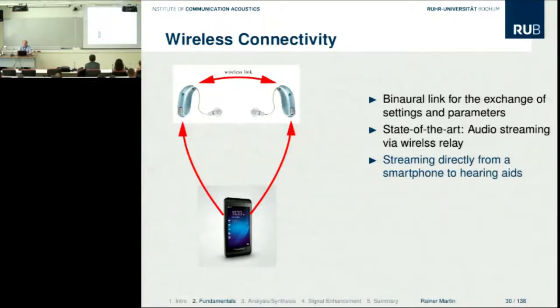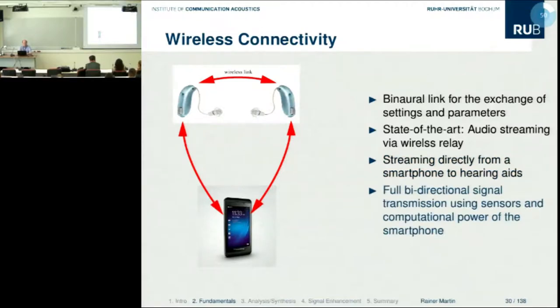And now there are some systems already, some very recent designs, which would also allow you to stream directly from your smartphone via Bluetooth, a low power version of Bluetooth, into the hearing aid. Standard Bluetooth, even though the power consumption is low, is still too high. And the goal would be, of course, to have it fully bi-directional, so you can stream data both ways and even process it in the smartphone. But as I said, power and latency are the big issues.